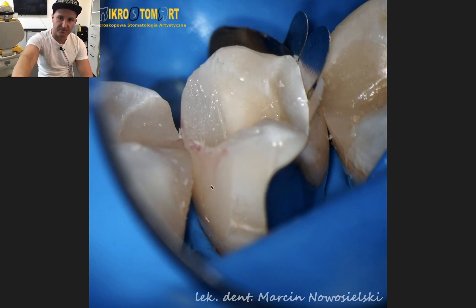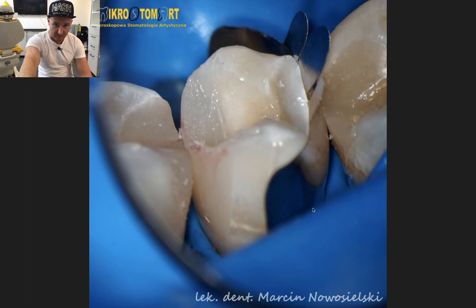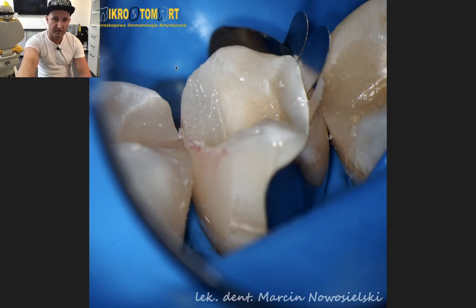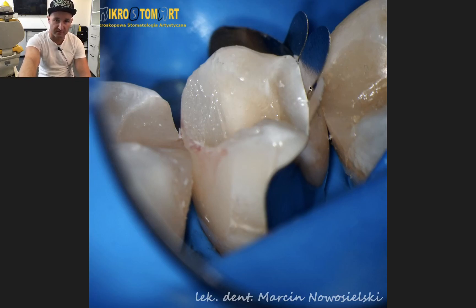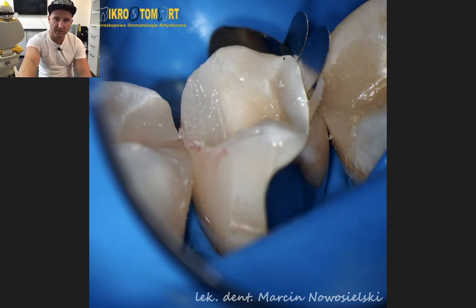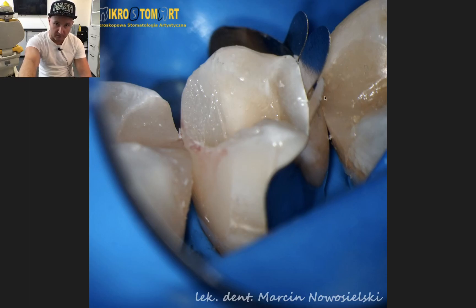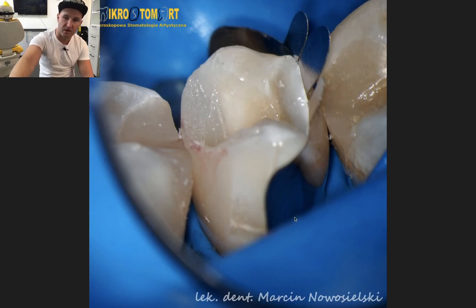Fast, easy, and effective. After that we start with the mesial wall. In such cases it is very important to do all the walls separately — not together — because you risk not getting tight contact areas. That's why we did the mesial wall second. We used a Bioclear matrix for this, which has a better shape, and in this case we could use it because the destruction was not so deep.